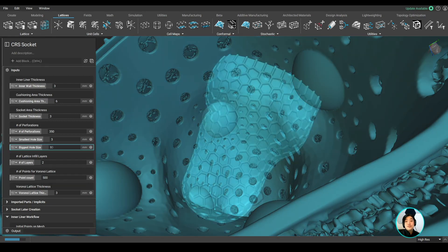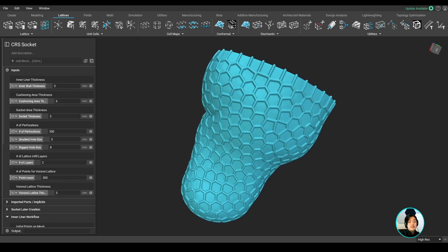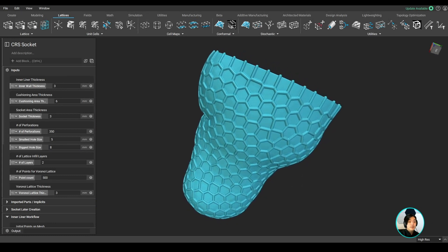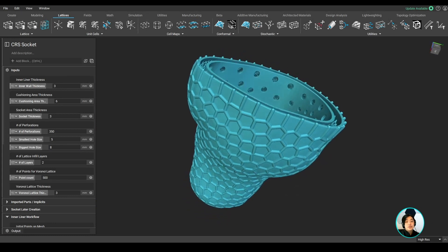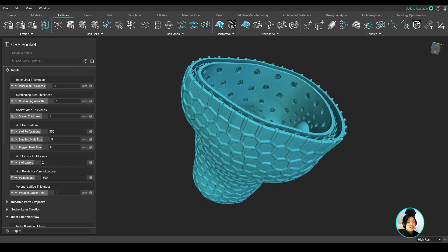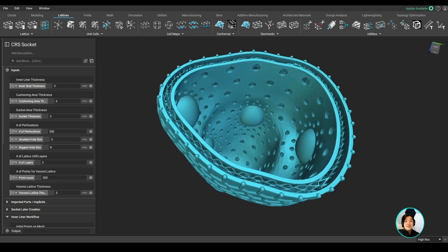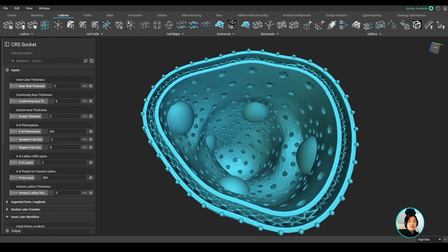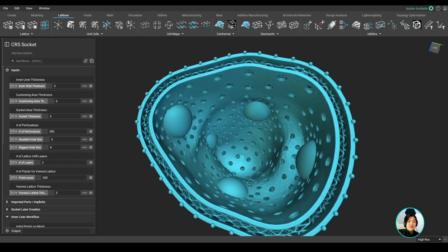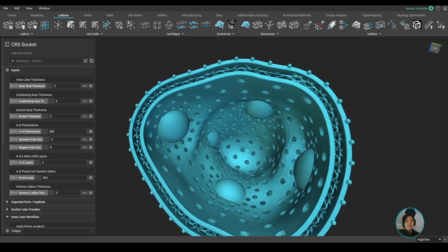These features I showed you in nTop enable mass customization workflows to work well and keep production costs low to match generic mass-produced products. I hope you got a lot of insight into what nTop is capable of. Thank you, and I hope you learned something new today.